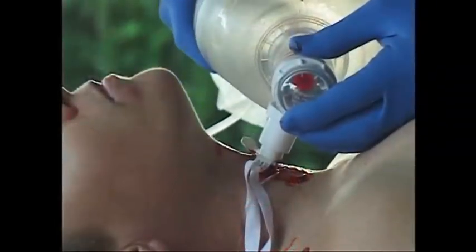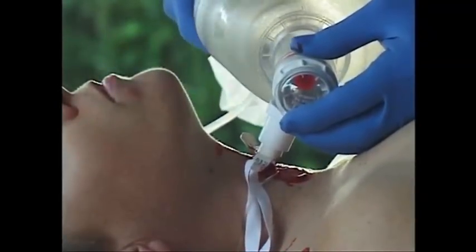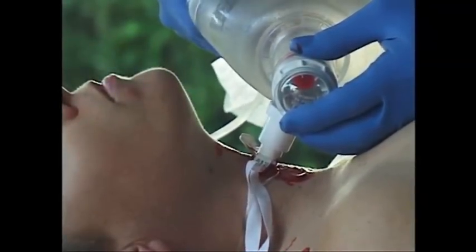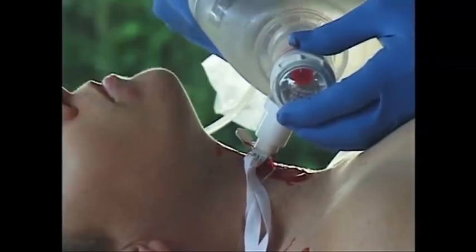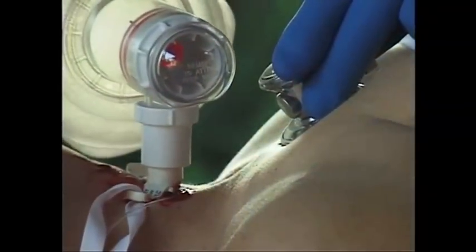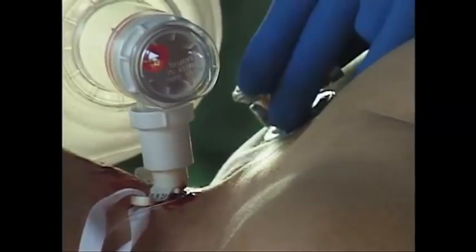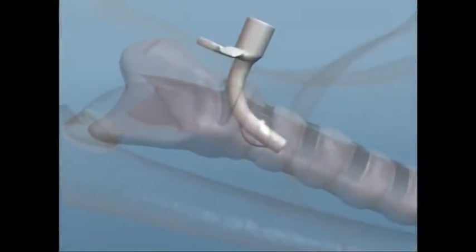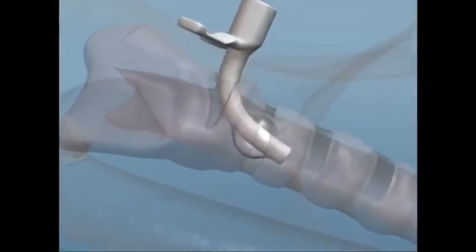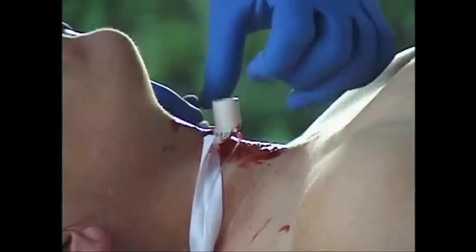Ventilate the patient by hand with a bag valve or with a ventilator at the highest available oxygen concentration. Auscultate lung sounds for proper placement. If present, inflate the cuff with 10 cc's of air and secure the tube in place.